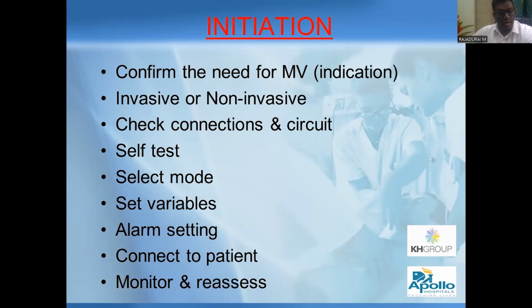As I tell my postgraduates, mechanical ventilation has to be a dynamic process. You cannot commence a mode of mechanical ventilation with specific settings at the beginning of your shift and leave the patient till the end of the shift. You need to constantly keep reassessing, and as and when required, make a subtle change or a massive change according to the variables and hemodynamics we have monitored.